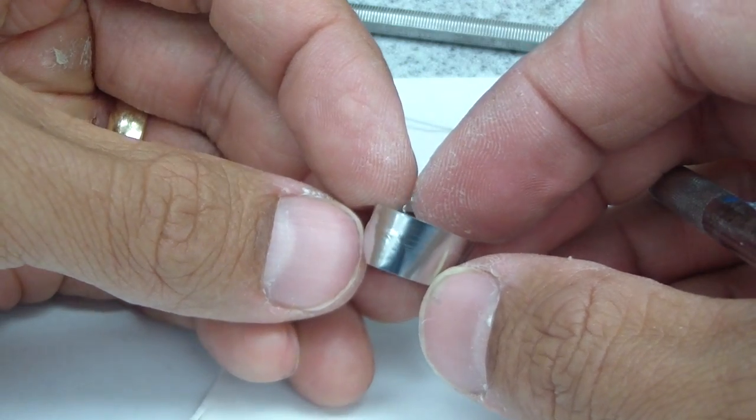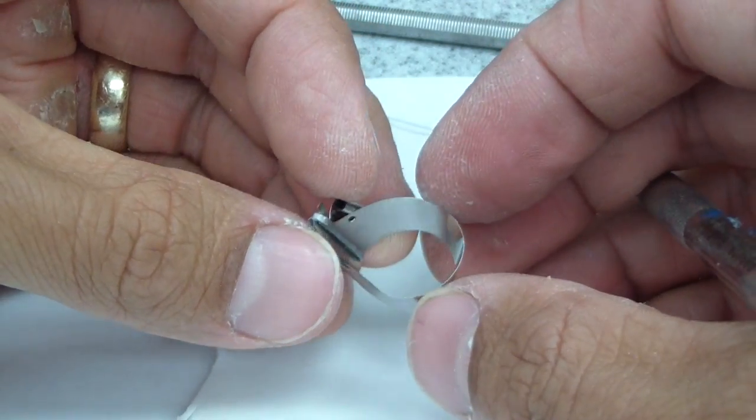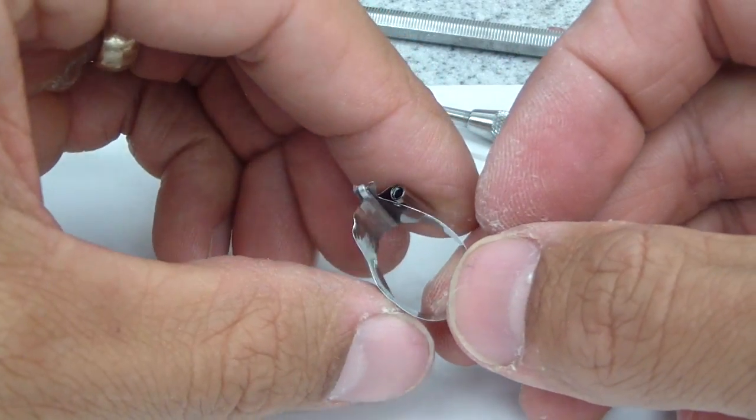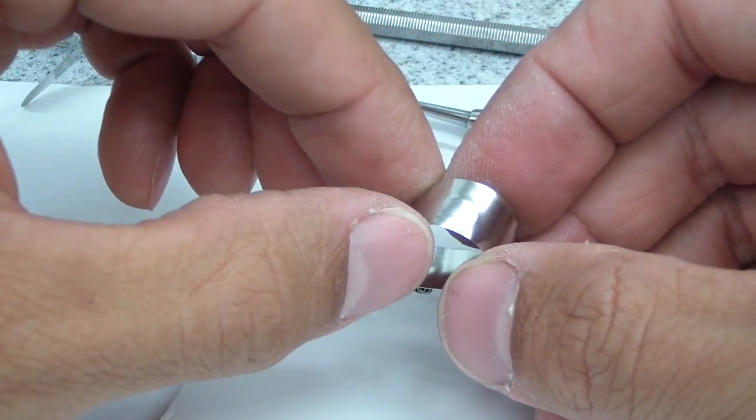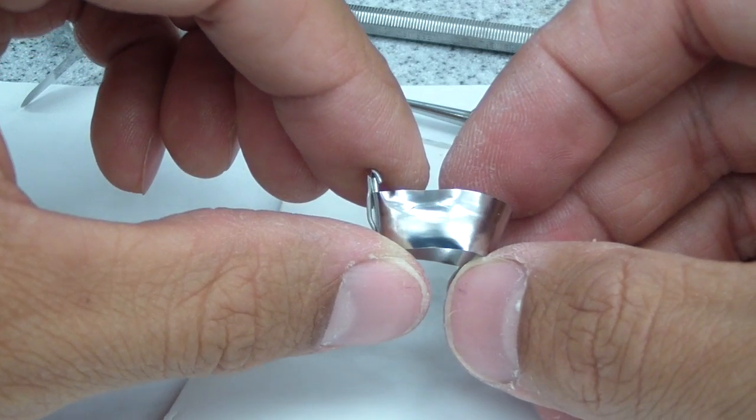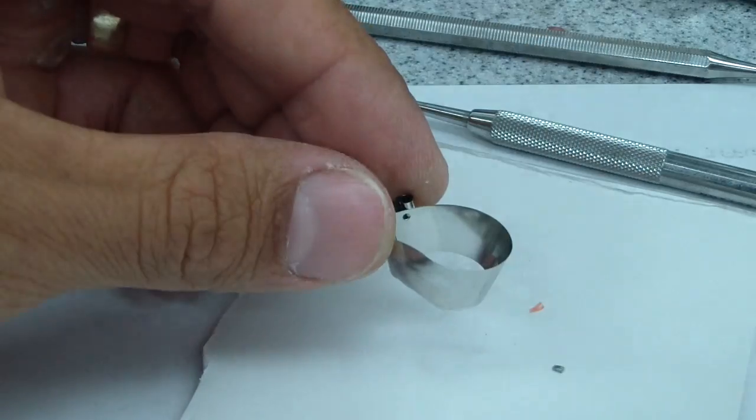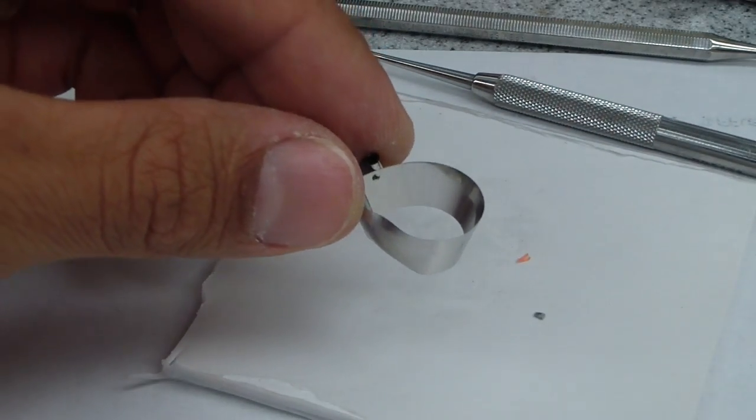So there you go. So just a little bit of help in placing, especially complex posterior restorations. Any little bit of subtle addition tips makes a huge difference in making a successful restoration. Fabricating a successful restoration. Cheers.